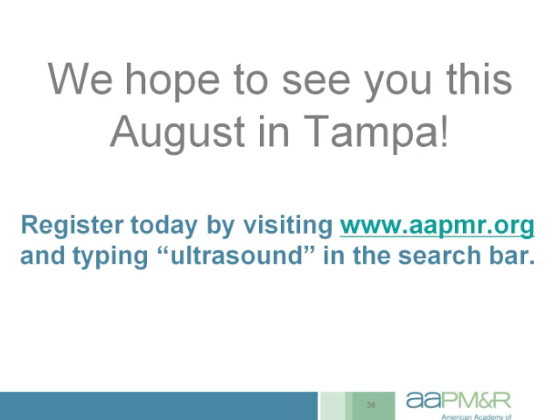I see another question here regarding piriformis injection. So in the particular case that I presented, and the question looks like in particular it's asking me, was that a, quote, piriformis nerve block? So I suppose there would be some circumstances for certain patients where you may want to perform a sciatic block intentionally. In the case of this particular patient, my goal was to treat piriformis muscle pain, and because particularly in this patient's case, they didn't have a driver that day, it was actually my goal to avoid a sciatic nerve block.